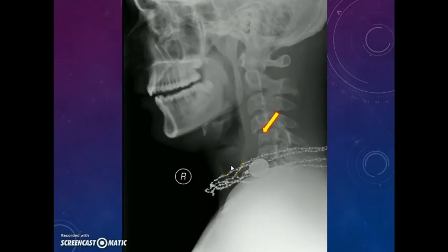This is another X-ray showing cervical spine injury — there is a stepping in that line which will be due to a subluxation. We should not miss a cervical spine injury because if we do, it can result in quadriplegia, diaphragmatic paralysis, and death of the patient.